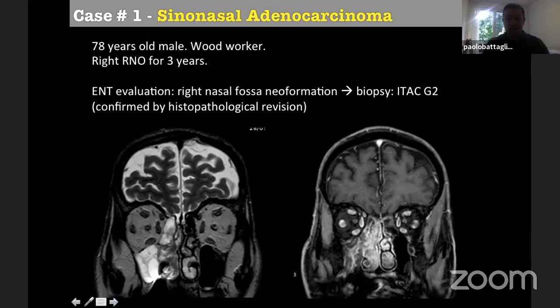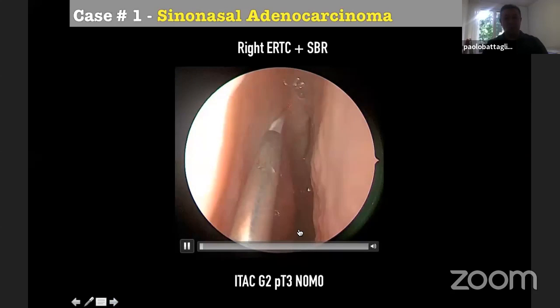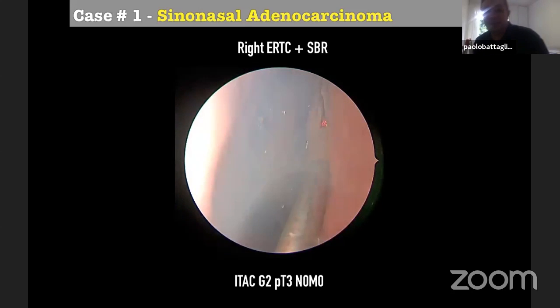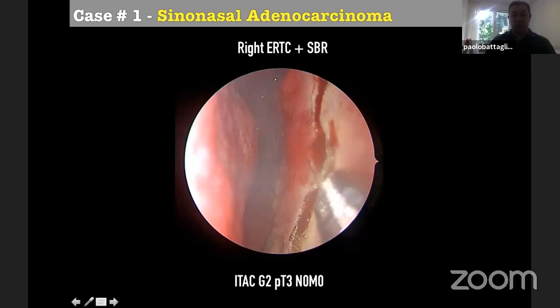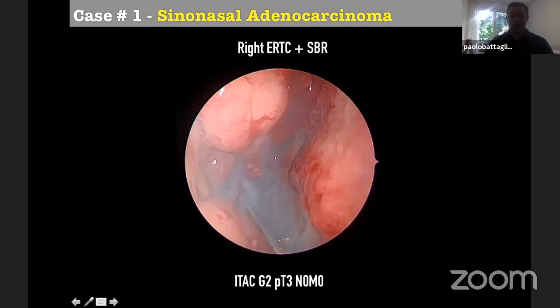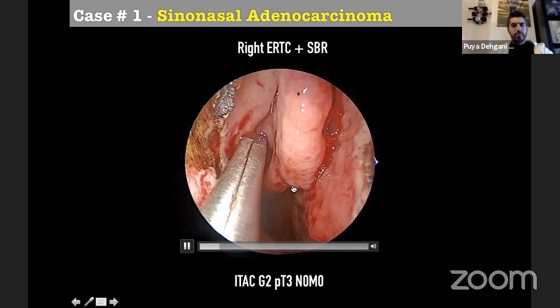So this is a case, you see this tumor involving the ethmoid on the right side. And you see here the tumor involving the posterior ethmoid. So we start as usual to remove the tumor with a centripetal technique. So this is the middle turbinate. We make our horseshoe incision at the level of the maxillary line and on the anterior part of the septum, then down at the level of the fontanelle area.